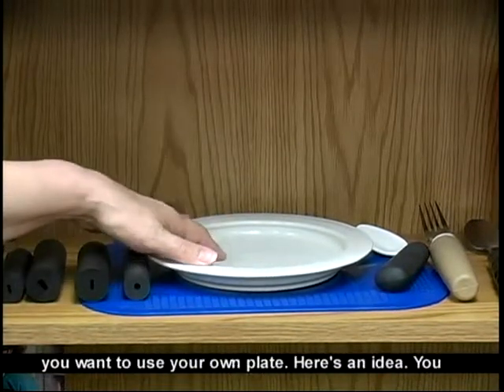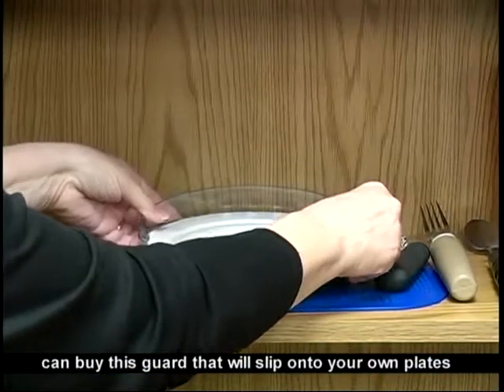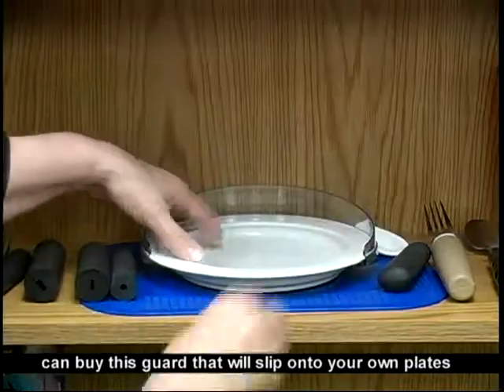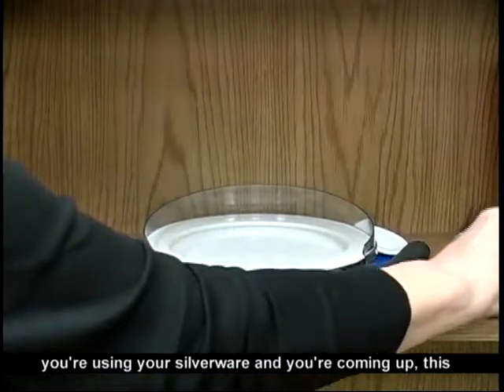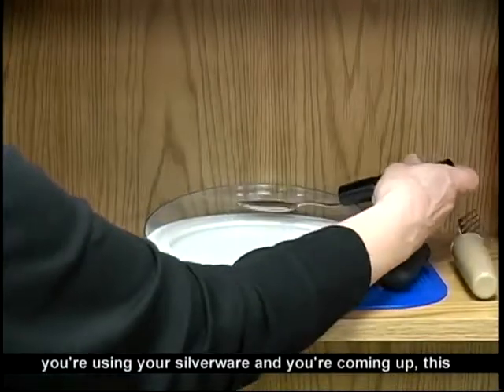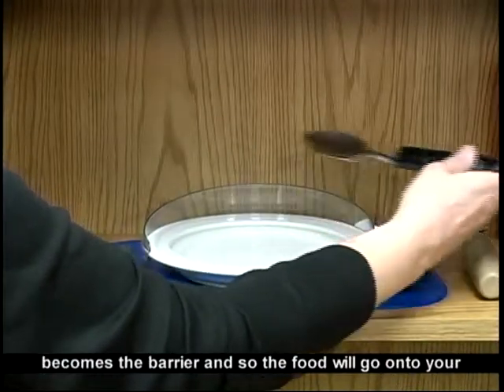But let's say you want to use your own plate. Here's an idea. You can buy this guard that will slip on to your own plate so that your plate looks like everyone else's. But when you're using your silverware and you're coming up, this becomes the barrier, and so the food will go onto your silverware.